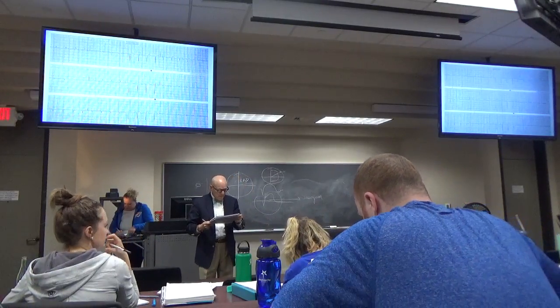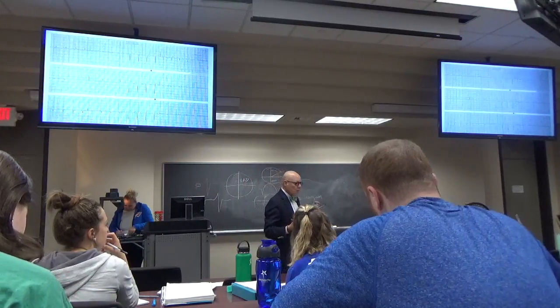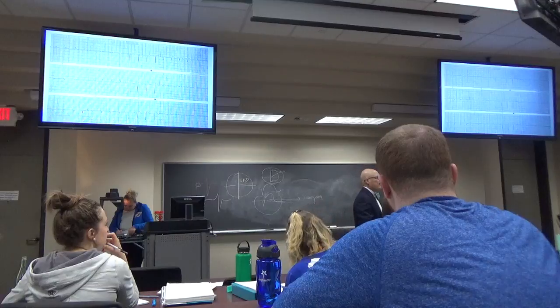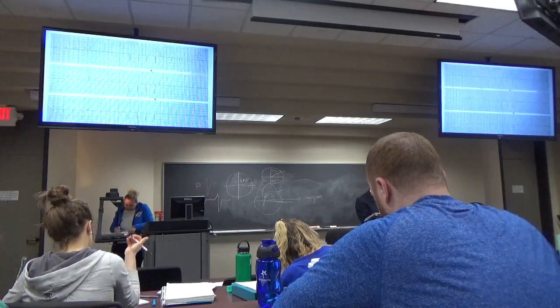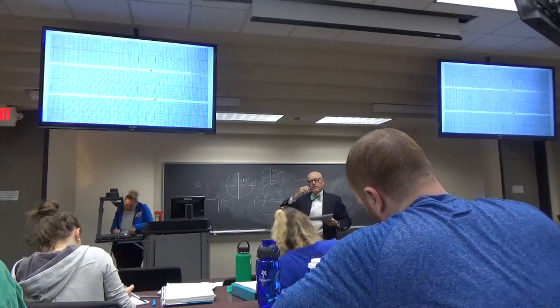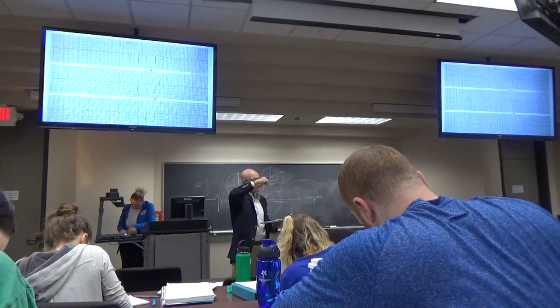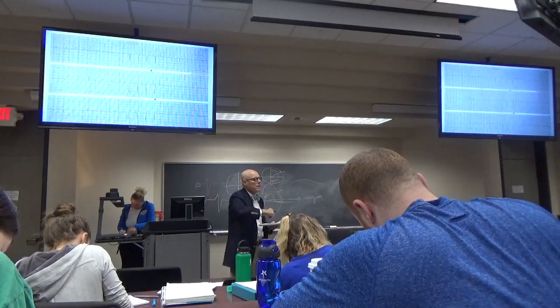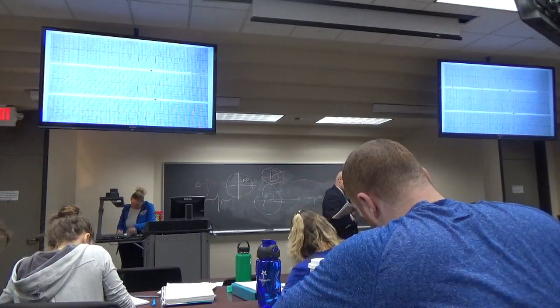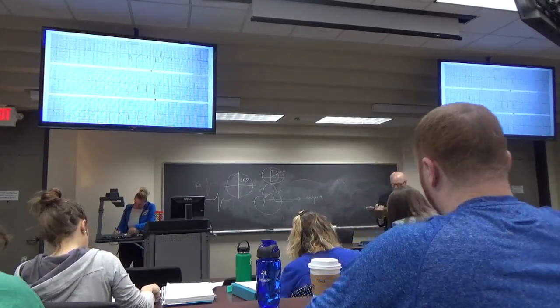Is it greater than 0.2? Yeah, so what I wrote down for the PR interval is 0.20 to 0.21. It sort of varies in the limits, and so I call it the first degree. It varies a little bit. This is one that's on the borderline, so I have to take my calipers and measure them in the limits to see if there's a first degree. Other questions?